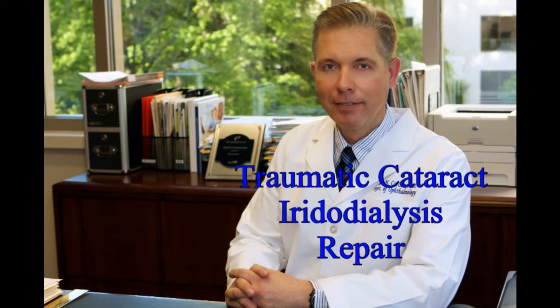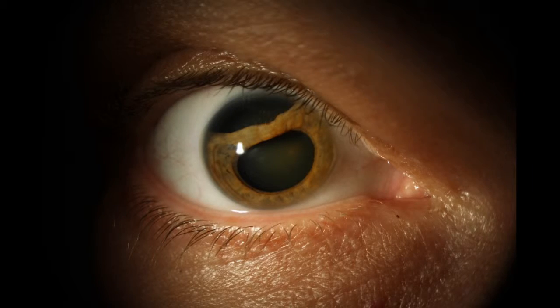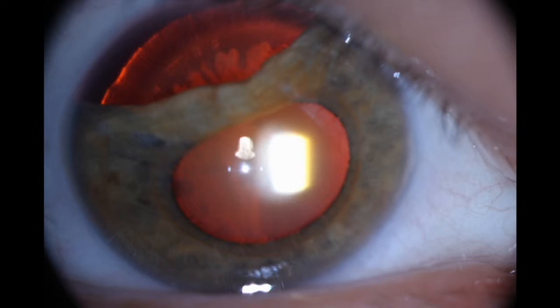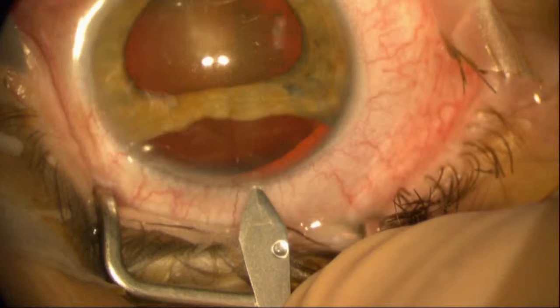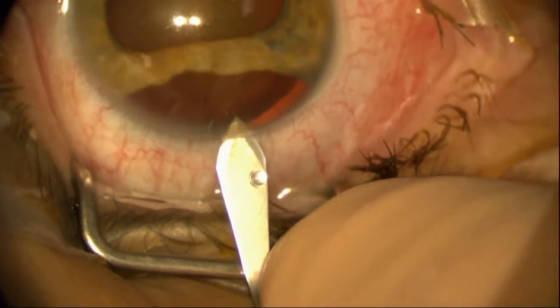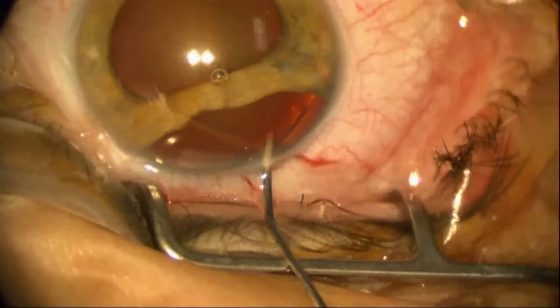Today's patient sustained a significant blunt trauma injury as a teenager, causing an iridodialysis. He now presents with a nuclear sclerotic and posterior subcapsular cataract for cataract surgery. Making an incision here.